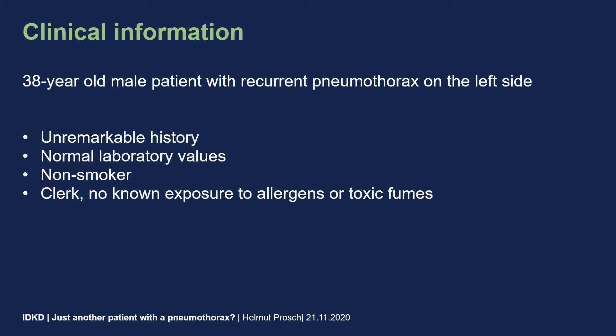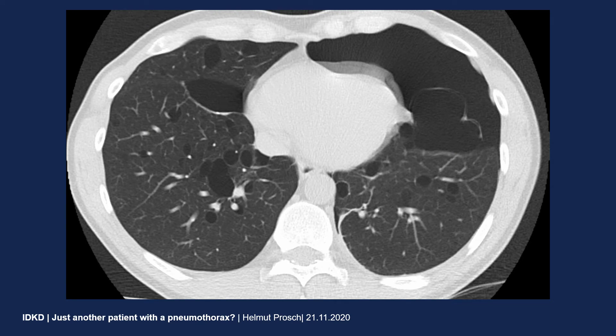Let's look at the CT scan. What you can nicely appreciate here is that most of the lung parenchyma looks quite normal. However, there are these very dark areas corresponding to very thin-walled cysts. Most of the cysts are either round or show a lentiform shape. If you look at the distribution, you will appreciate that most of these cysts are either close to a fissure or close to interlobular septae.